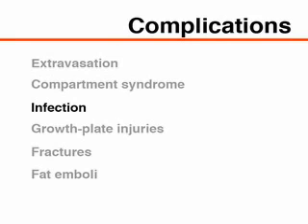Introduction of skin flora or other pathogens can lead to infection at the insertion site, within the soft tissue, or in the bone. Using proper aseptic technique and limiting the time the intraosseous catheter is in place can minimize this risk. Prophylactic antibiotic therapy is not routinely recommended. Although not reported in the pediatric literature, growth plate injuries can occur if an intraosseous catheter is inadvertently directed into a physis.